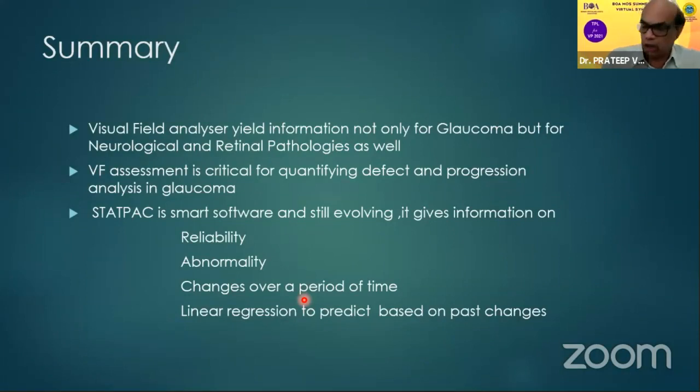And it does a very good progression analysis. And the VFI has been added to our armamentarium for the good assessment of the progression of glaucoma and the prediction of glaucoma, of what the patient will do 3 years or 5 years from now.